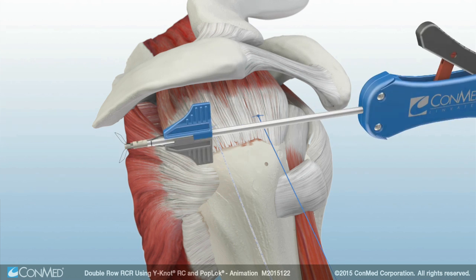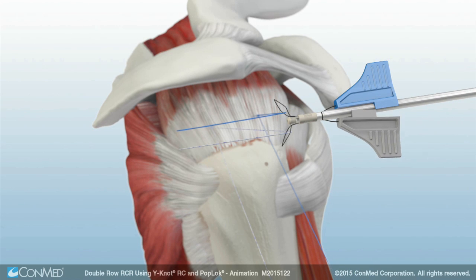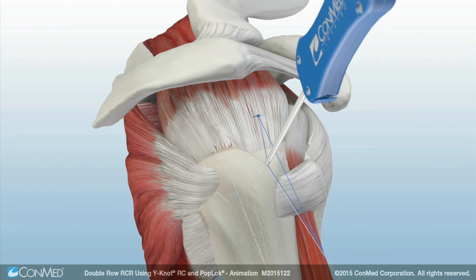Two suture tails from the medial row are loaded into a 4.5 pop-lock knotless suture anchor. The anchor is inserted down to the laser line and sutures are tensioned as needed.